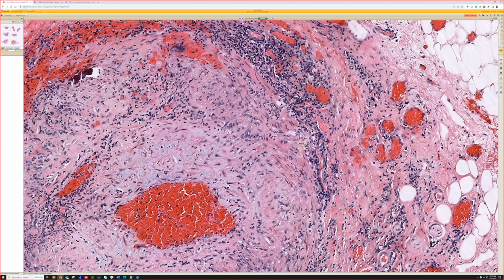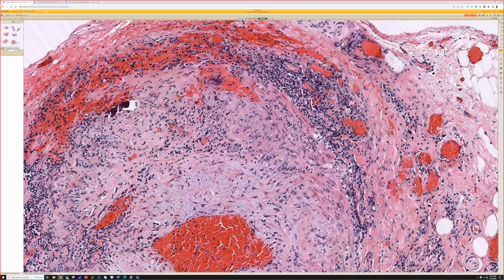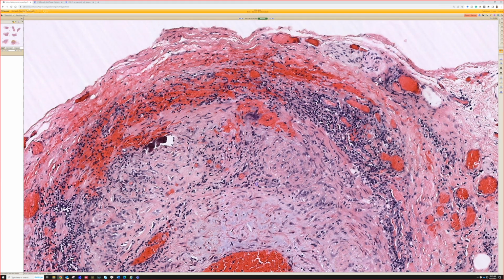But in the setting of a patient with headaches, jaw pain, vision disturbance or loss, where there's clinical concern for temporal arteritis, and they do a biopsy, usually they're going to have elevated ESR, erythrocyte sedimentation rate, and C-reactive protein, because there's an inflammatory process. In this context, even if I find a little focal bit of lymphocytes or histiocytes in the wall of the vessel without giant cells, that's very concerning for giant cell arteritis.